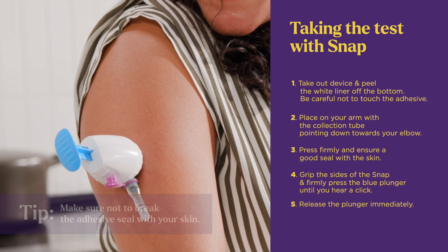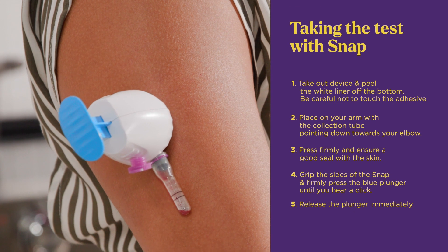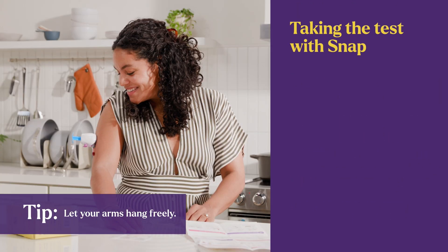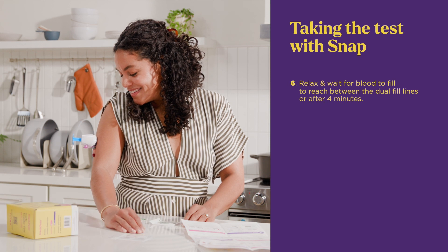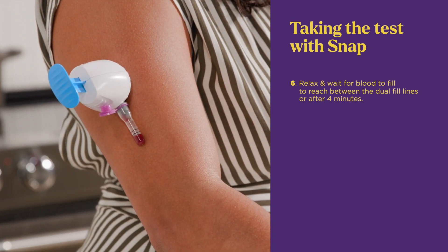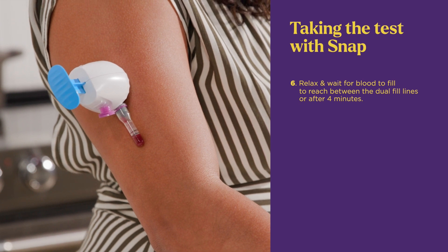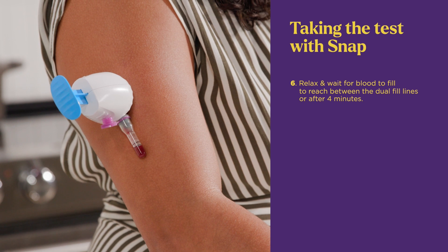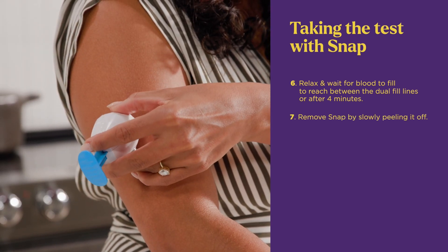Release the plunger immediately. The suction generated as the plunger releases is what draws your blood. Relax your arms and wait for blood to reach between the dual fill lines, which takes 1–4 minutes. When your sample volume is between the black lines, or after 4 minutes — whichever comes first — remove the snap by slowly peeling it off.